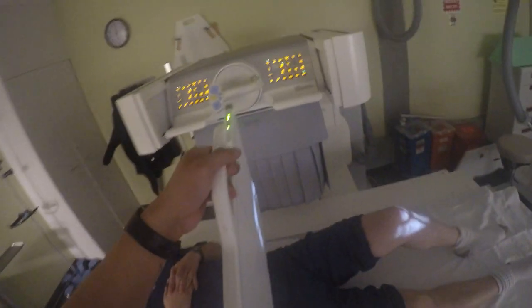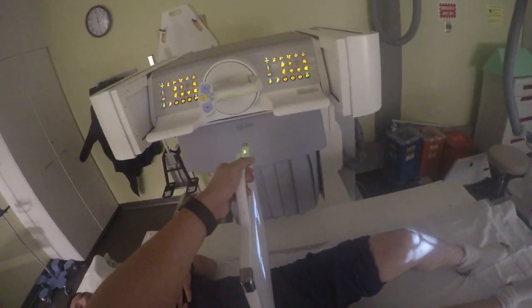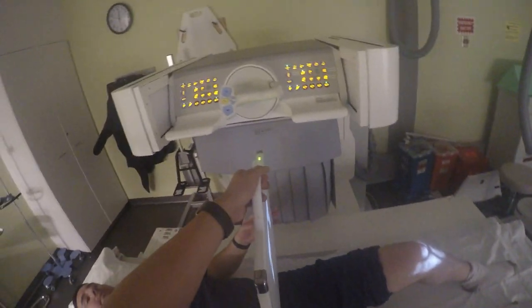I'm going to move this — okay, got some weight on it, alright? Okay, you're going to hold it with both hands. You okay?